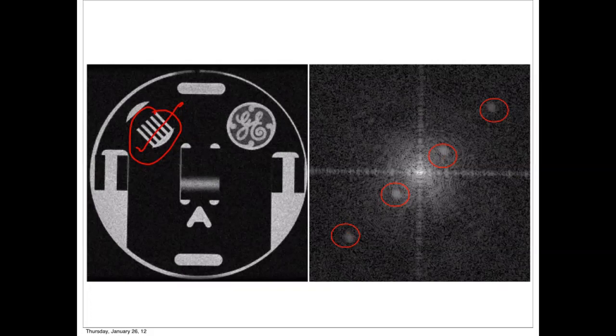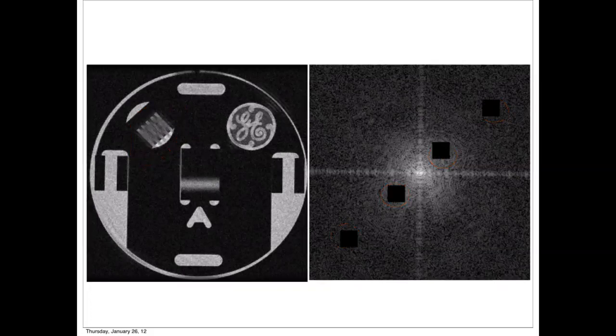And actually you can verify that this is the case by basically erasing them. If I erase these, look what happens. It flattens that comb, barely touching anything else, but not completely. Interesting, huh? The other thing is that this line over here comes from the fact that there are a lot of edges that are horizontal. Every edge that is horizontal means that there is a big change.